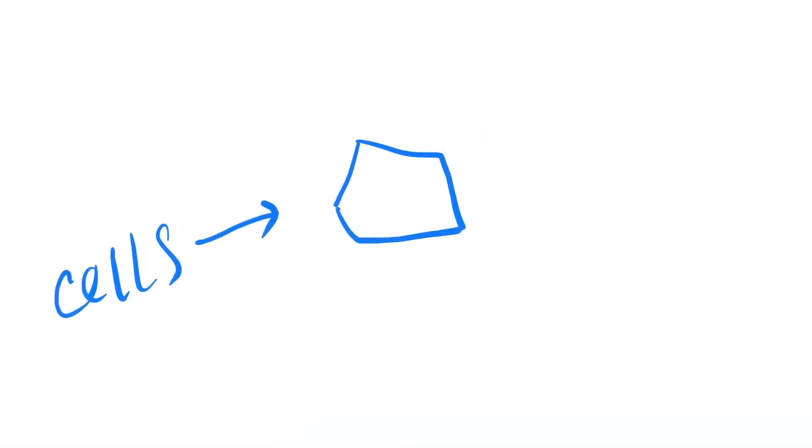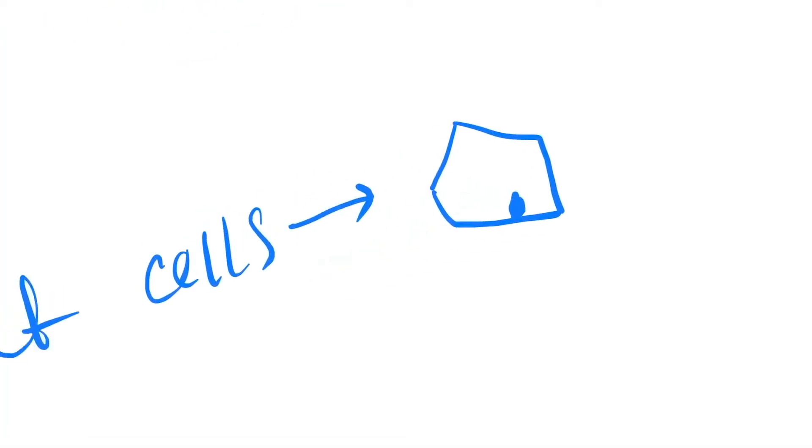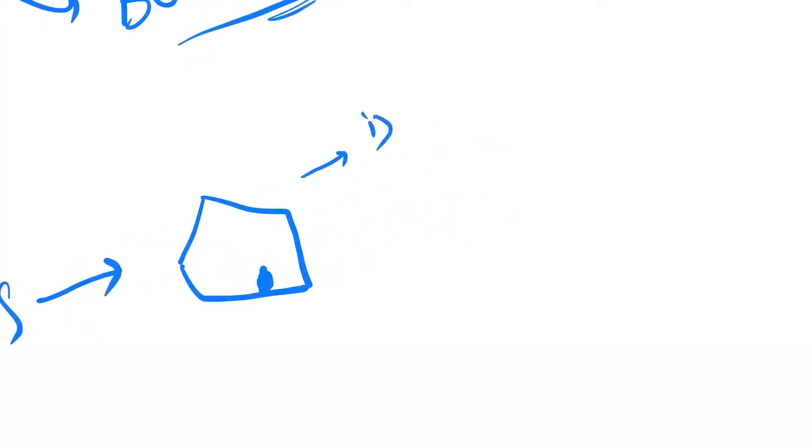Polygonal in nature. The center will be completely vacuolated and the nucleus will not be in the center, it will be eccentric in nature. So this is the feature of the fat cells.